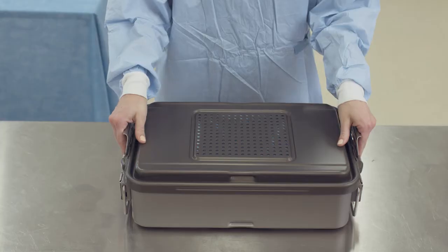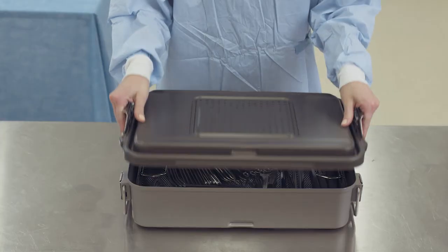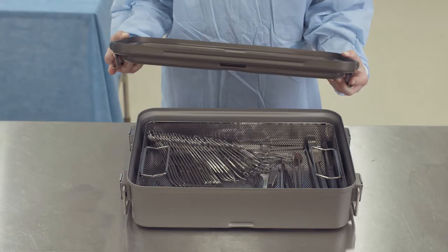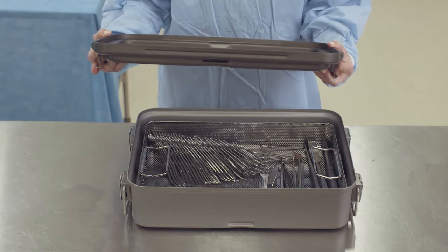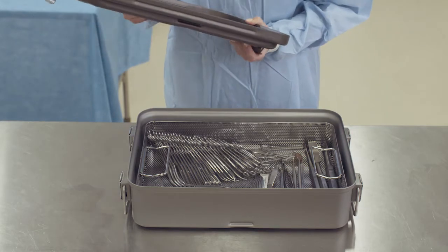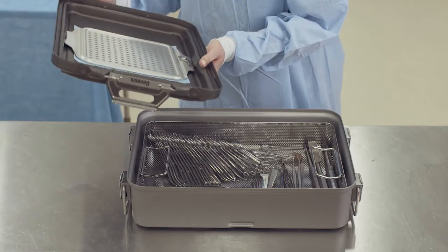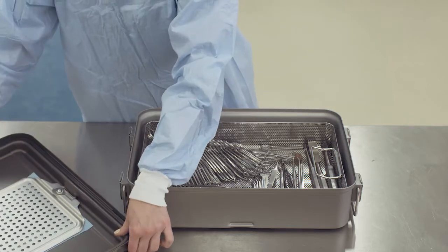Lift the lid vertically up and off the container bottom. After removing, inspect the lid. Check the gasket to ensure there is no damage or separation from the retaining groove. Inspect the filter and retention plate in the lid for correct placement. Inspect the filter for any visible tears or punctures.